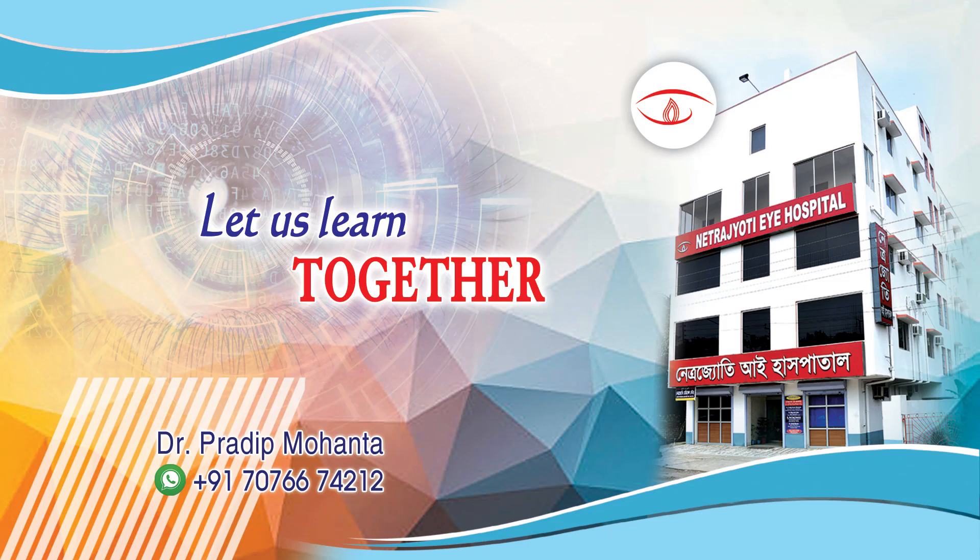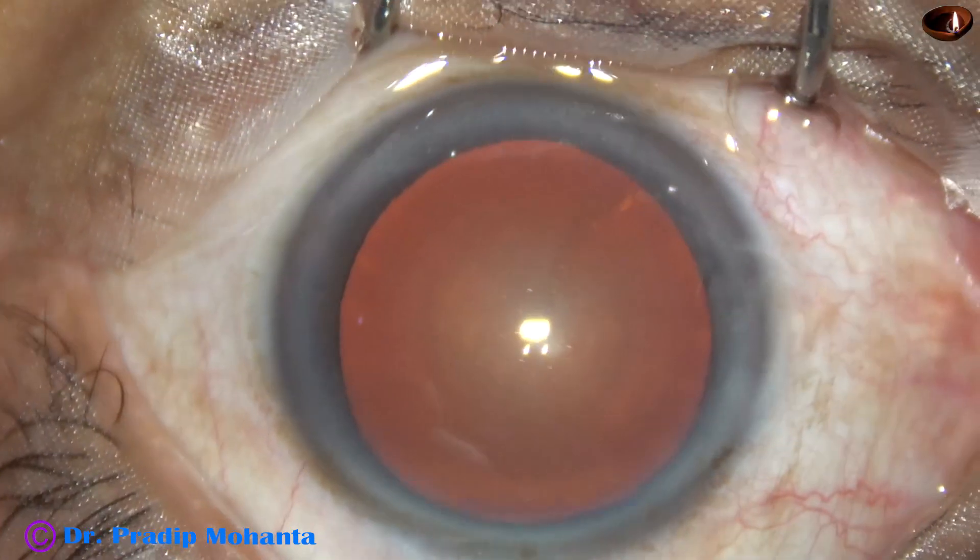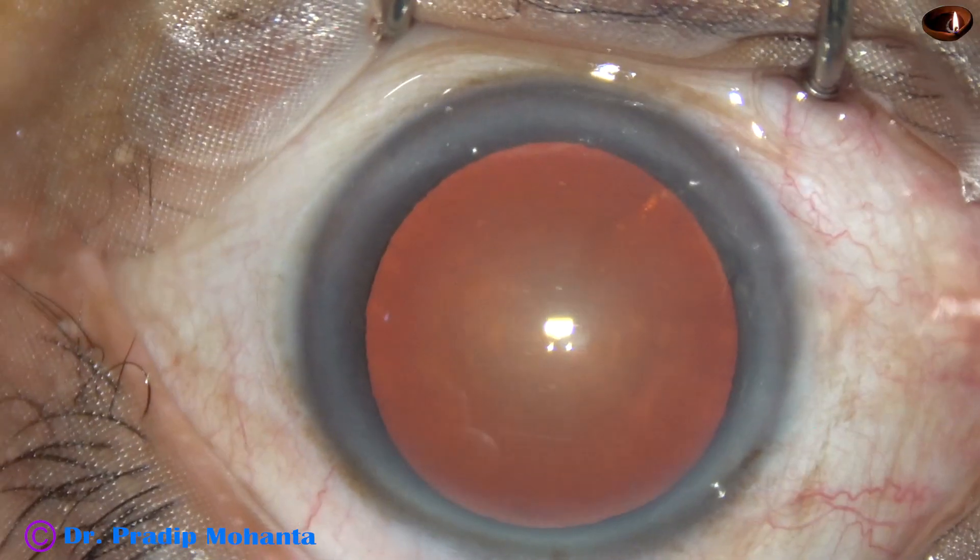Friends, welcome to my workplace at Rana Ghat, West Bengal, India. Let us observe this routine unedited phacosurgery.